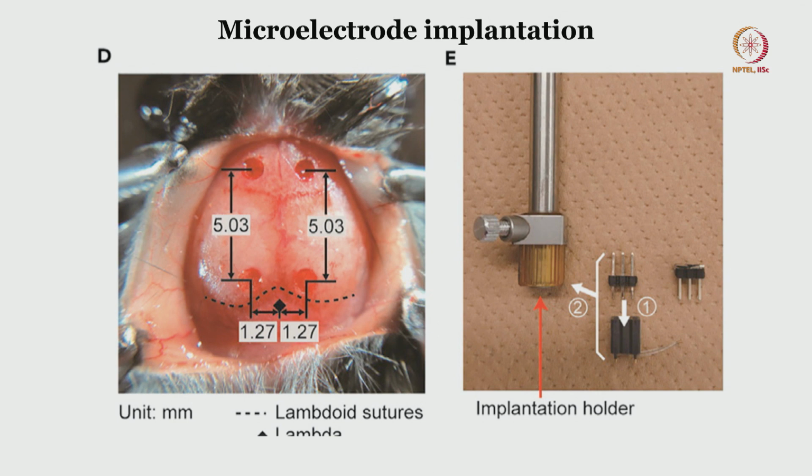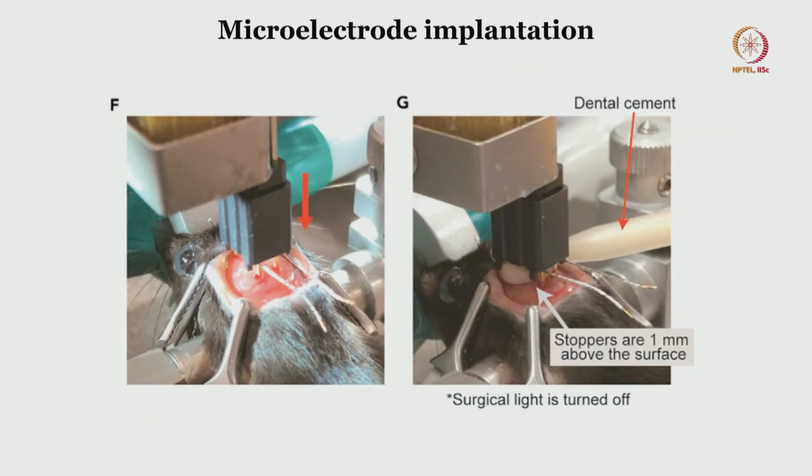So, once your burr hole is made and the implant is mounted onto the adapter, you are good to lower it down. This is the zoomed in view wherein that is the adapter holding the implant, and you can see the electrode in the tip of this particular implant. These wires are concerned with the EMG.